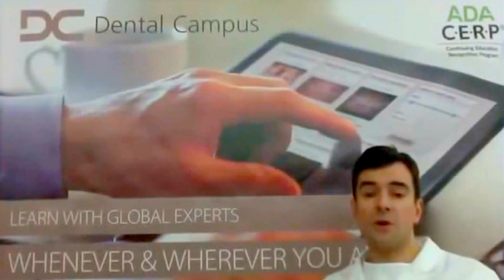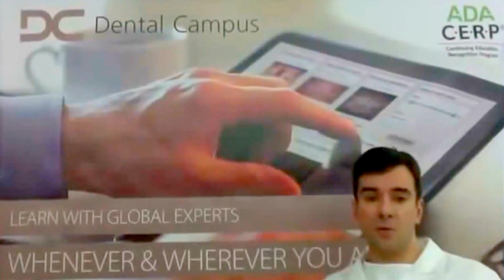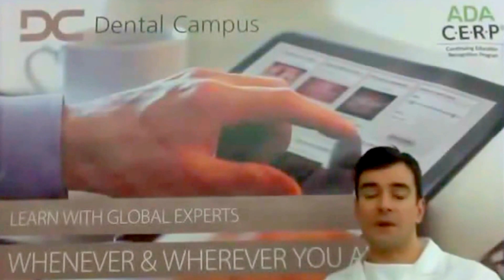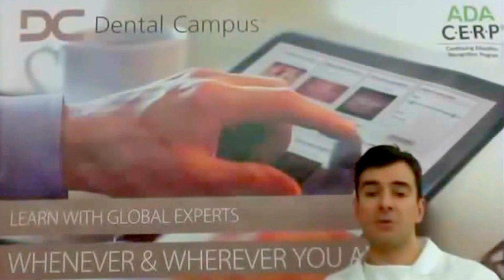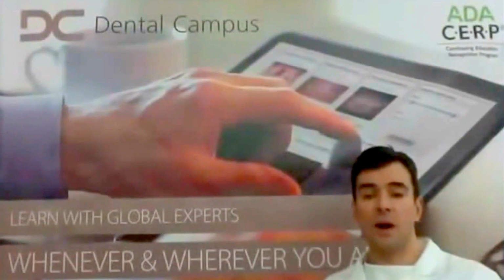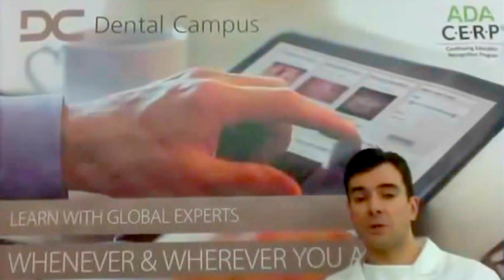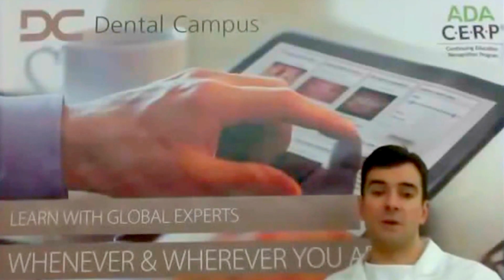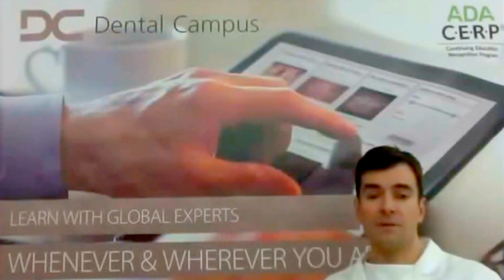Of course, the following question is, are we reconstructing in the posterior jaw segment or in the anterior? I would say that in the anterior segment, in which the chewing forces are not so high, there are not too many problems. So in the anterior, my first choice for 2 missing teeth is to place 1 implant and a cantilever.